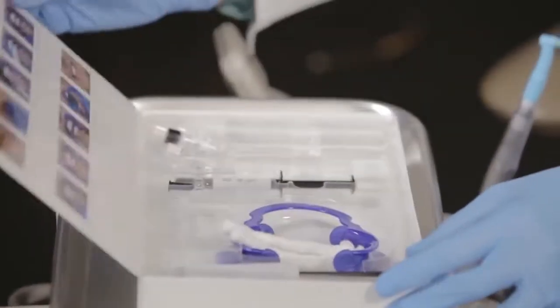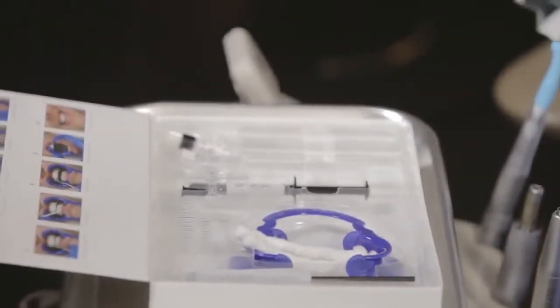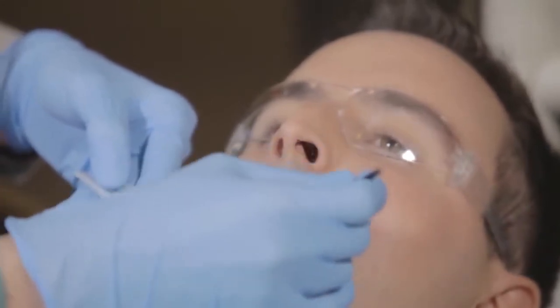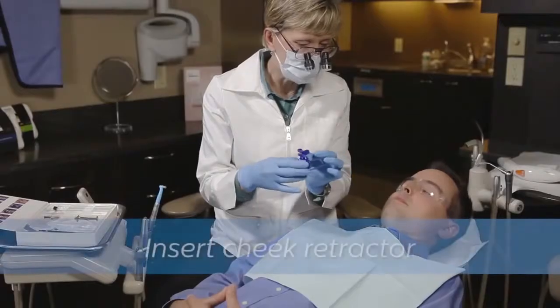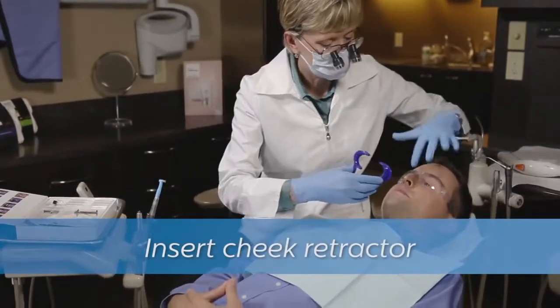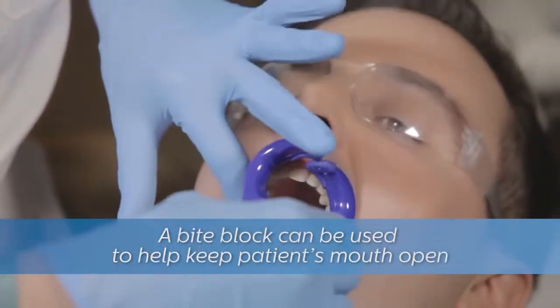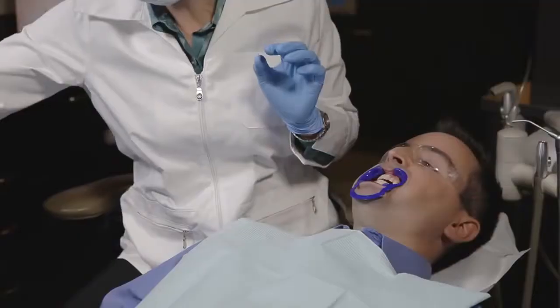First, make sure the patient is wearing protective eyewear. Then apply the provided vitamin E oil to the patient's lips — this will help maximize comfort during the treatment. Next, insert the provided lip and cheek retractor. For some patients, the retractor may fit more comfortably with cotton rolls added.